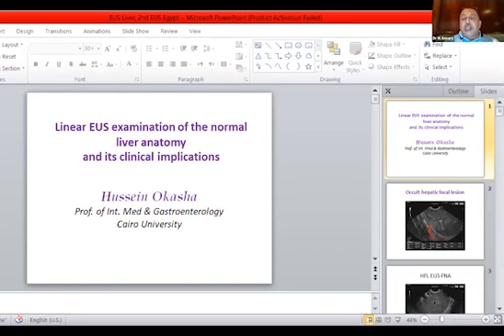And last question, this may open the interventional EUS-guided therapy, for example, radiofrequency or alcohol injection, as long as we can manage the position and the sites of the lesions.